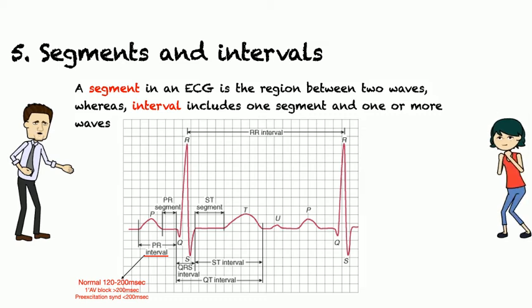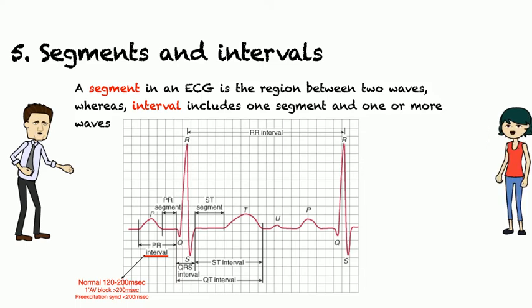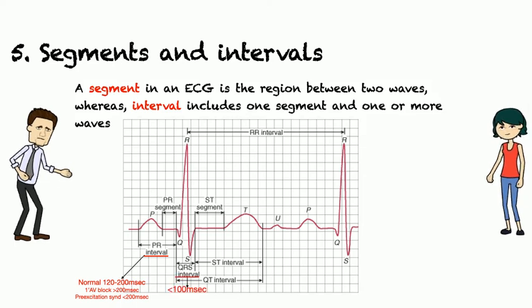Jenny, do you remember the normal duration of QRS interval which we discussed earlier? Up to 100 milliseconds. Excellent.